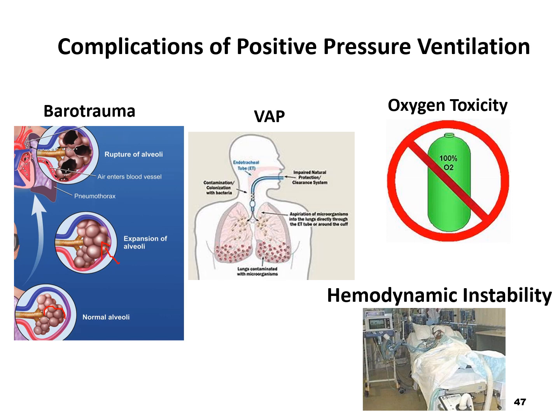Obviously, VAP. We have your ventilator bundle to prevent ventilator-associated pneumonia: good mouth care, keeping secretions out of the back of the endotracheal tube, and keeping their head of the bed up. These are all things that we want to follow to decrease the chance of VAP.